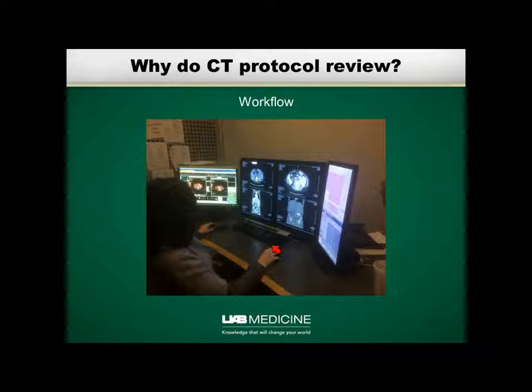Unfortunately, we haven't been standardizing the Recon series descriptions. With 15 different scanners and routine body protocols, you might have an abd-ax on one, abd-pel axial on another, body-ax on a third. This drives the hanging protocol software nuts. So if you tell your department chair, I can fix your hanging protocols, then the next thing you do is start looking at what those Recon series descriptions are.